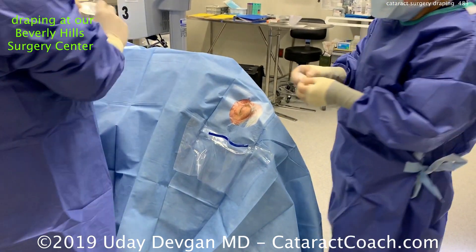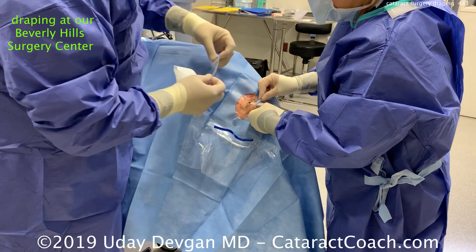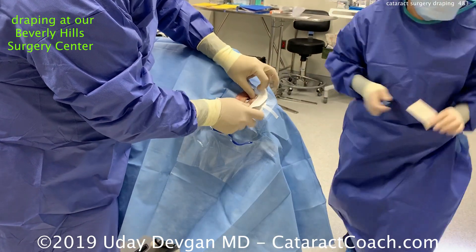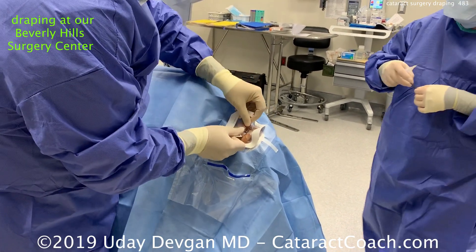Now my assistant will use a SteriStrip and the back end of a Wexel to lift up that upper lid, and now place this Tegaderm — and that'll get every single eyelash out of the way.